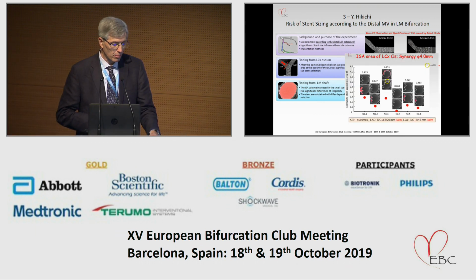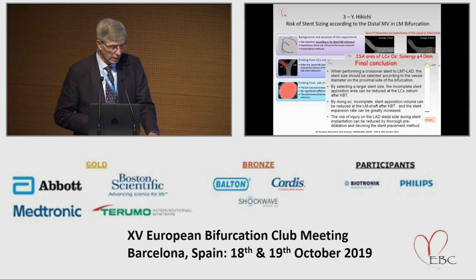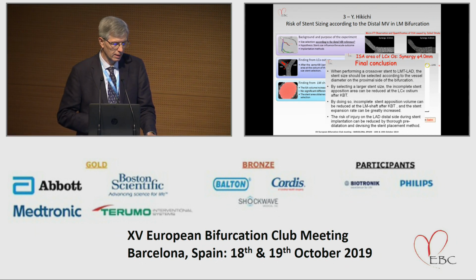This is just an example of the results, and it was possible to see how, in the different configurations with different geometry and different balloon pressure, the results were quite different. His conclusion was that, again, also for this problem, a proper and appropriate choice of the stent is important to reduce the effect of the malapposition of the struts.